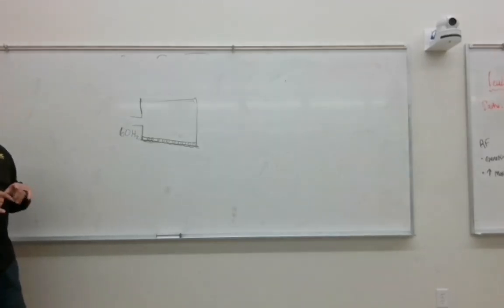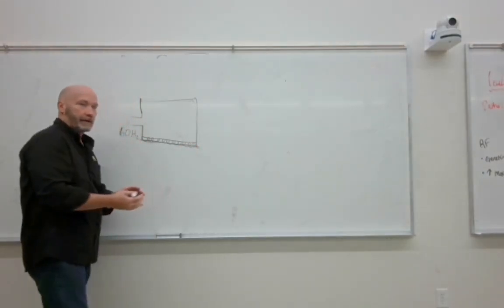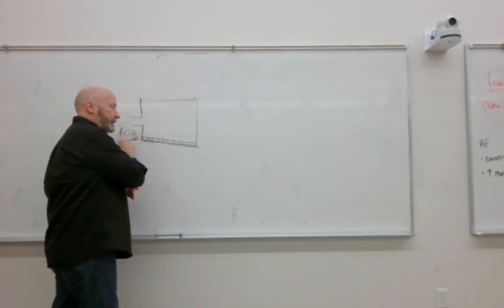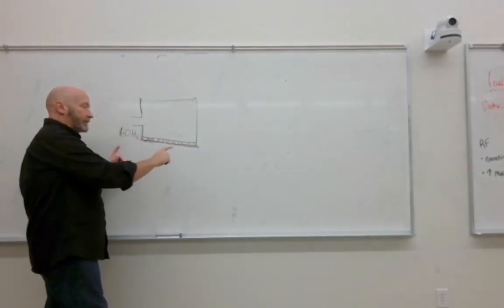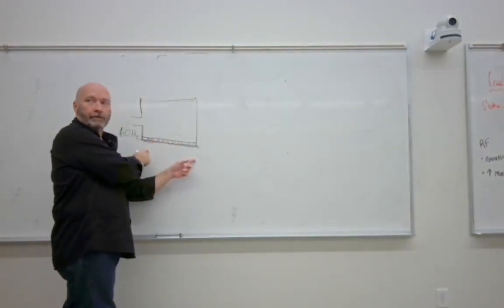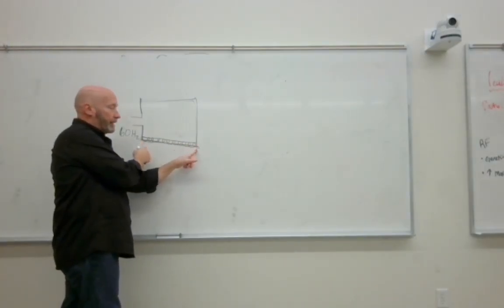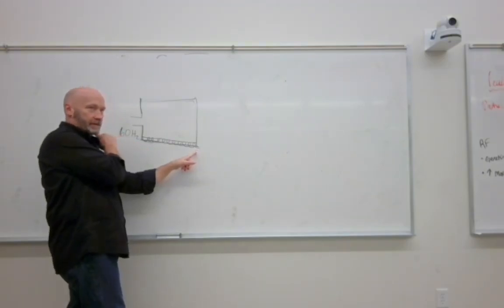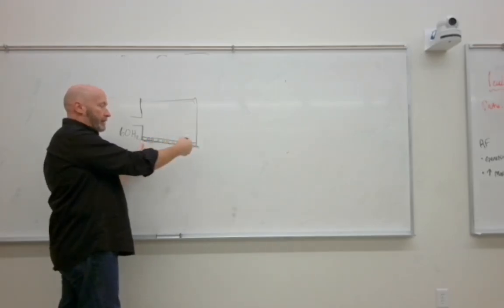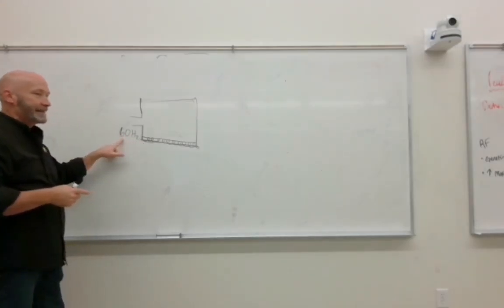And what that does is it takes the magnetic, this is still a magnet, right? And magnets have two poles. And because of the direction of the electrons going in and out, it switches the polarity back and forth and back and forth. So we've got the North Pole down here when the electricity is coming in, and then the North Pole down here when the electricity is going out. So it flips it 60 times per second.